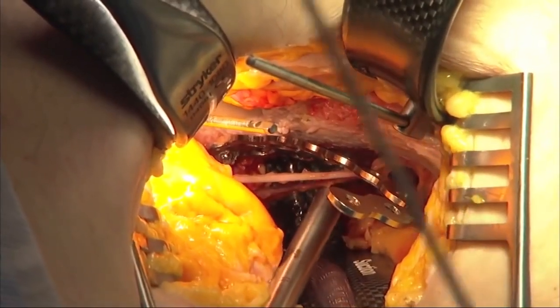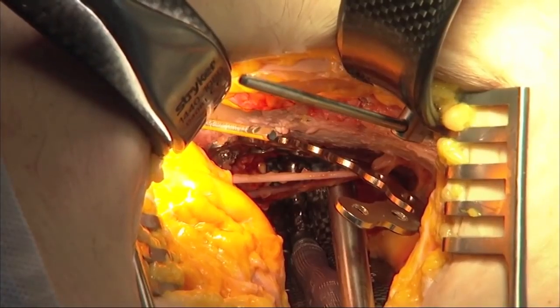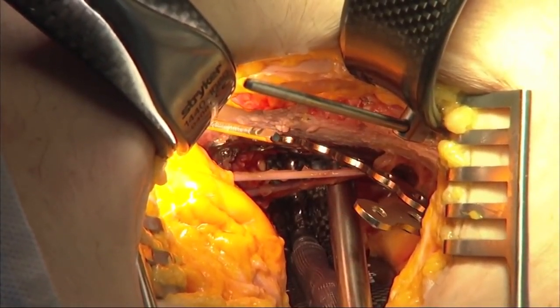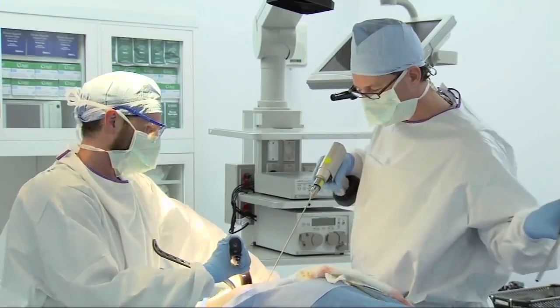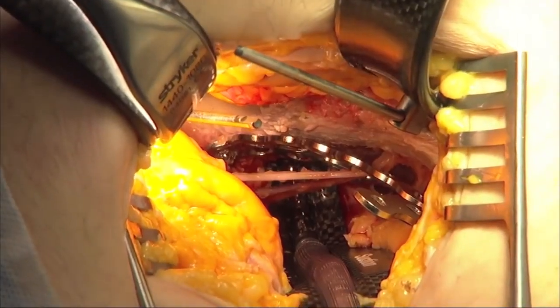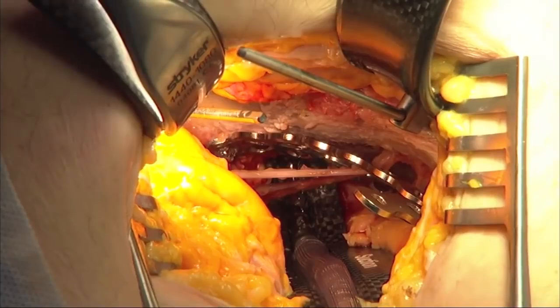Here we're placing a screw down at the most inferior aspect of the plate, which is a difficult spot to get to because it's so low on the posterior column and deep inside the wound that the angle is difficult to measure off of. So we have a new angle depth gauge that we've developed specifically for measuring down along the posterior column and the lower aspects of the quadrilateral surface.